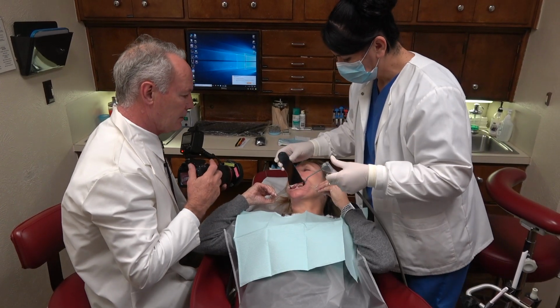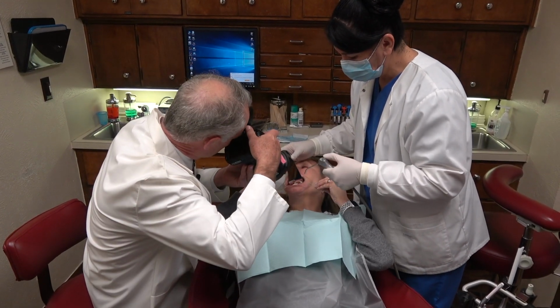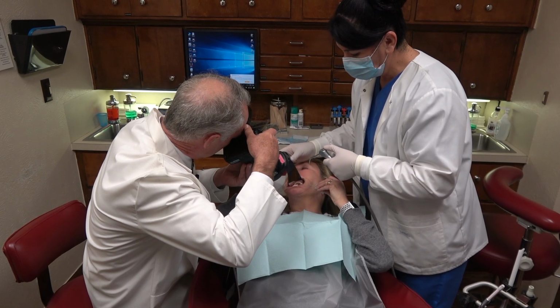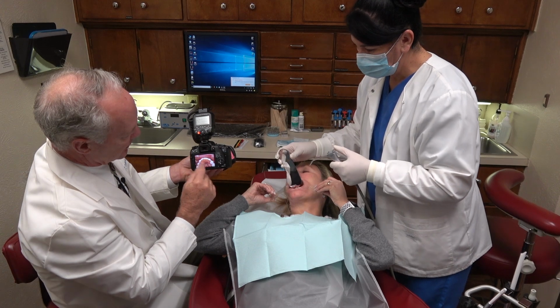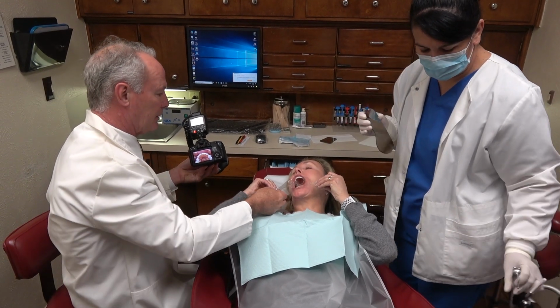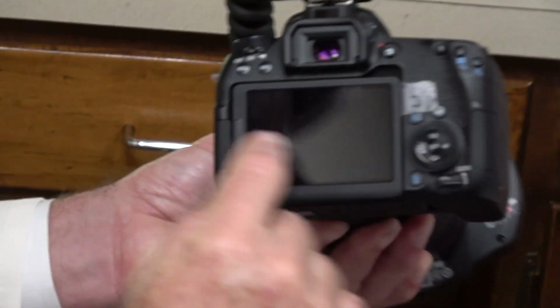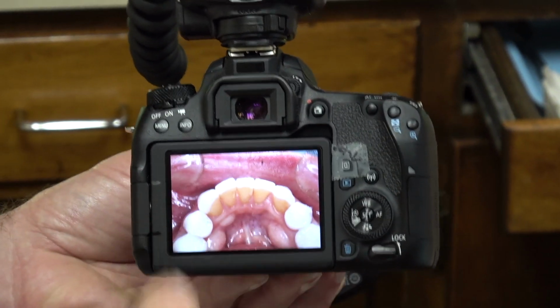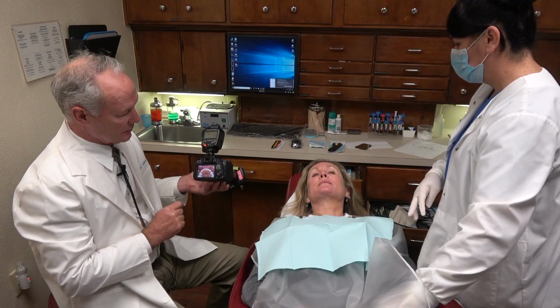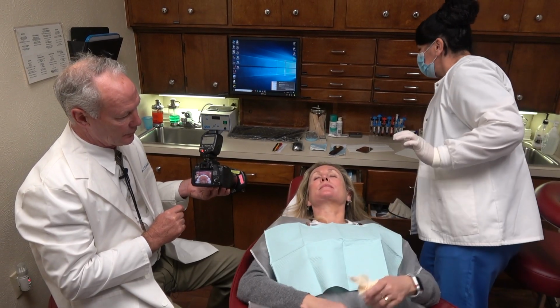Then one more. The incisal edges of the lower anterior teeth and the lingual of the lower anterior teeth. So this shows any buildup. Thank you, Sharon, you can take those out. So this shows any calculus buildup on the teeth or chipped incisal edges. So those are the photographs we take of the teeth.